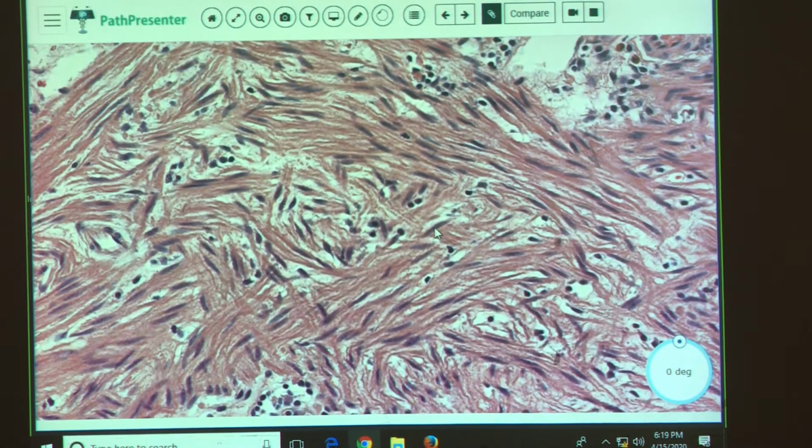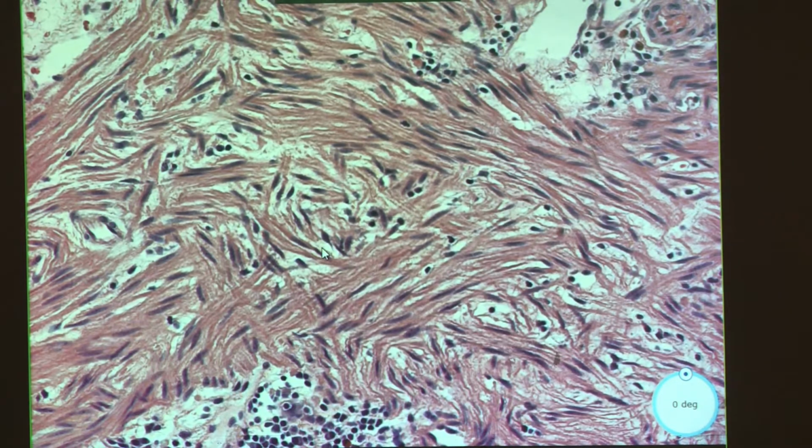Okay. So I have one more. Full screen. I can't tell you how many times I did that last week when it was just me. And all of these are good, so you can pick whichever one you like.